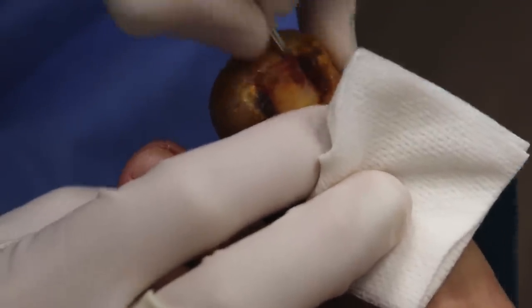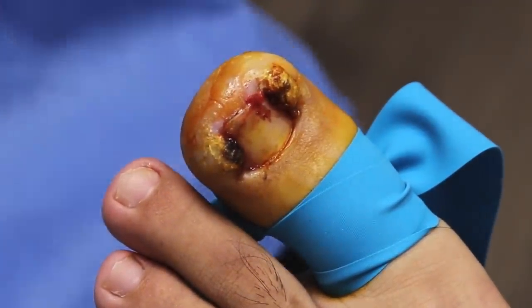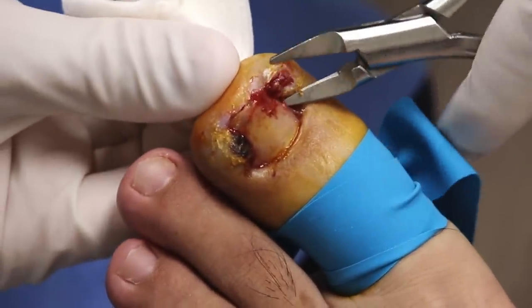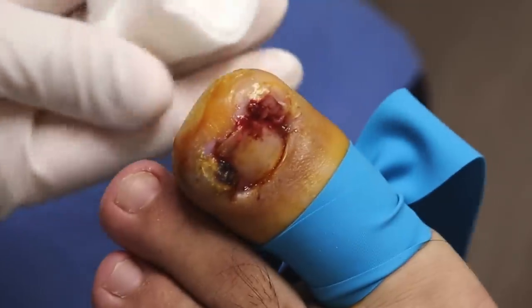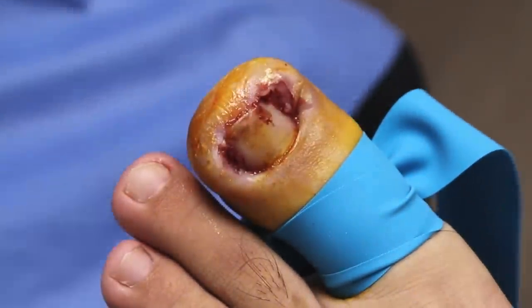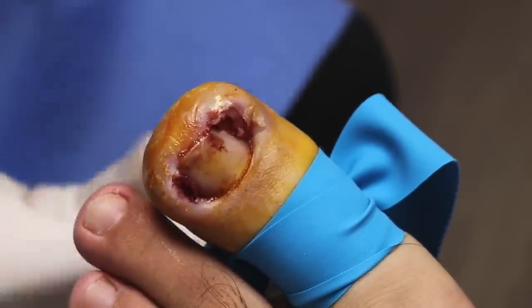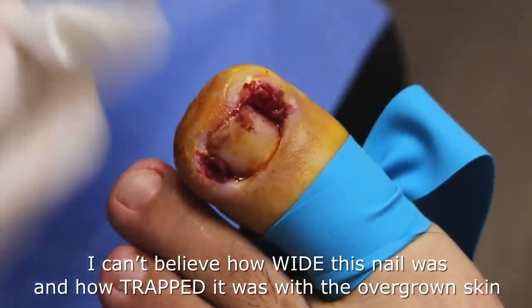Pain down here? No. So what I want to do, I just want to remove just this easy bad stuff so I can see a little bit better the nail. The nail is completely, completely trapped. There's no way it's getting out. A few days before I cut that nail and it was completely out, but then it started going again. It is so, so wide.